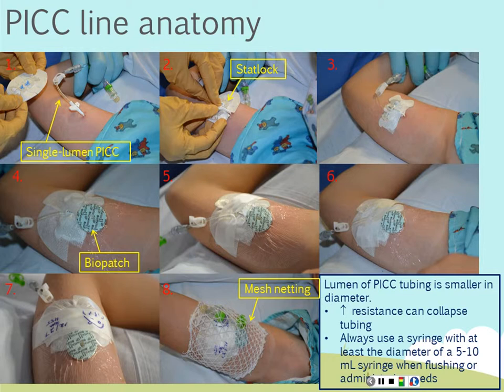Okay. How long are we going to infuse our medications over in minutes? Just a hint, the doctor does not order this. So you always want to know your resources and your references. You can look up your medication in a drug reference resource, either online or using a hard copy of a drug reference book, and you're looking specifically for the infusion rate or time. If it tells you to infuse it over 30 minutes and you have 50 mils of medication, you're going to set the pump at 100 mils an hour. If the pump just wants an infusion rate, that'd be your infusion rate. If it just wants an infusion time to be input, then you would just input the 30 minutes.